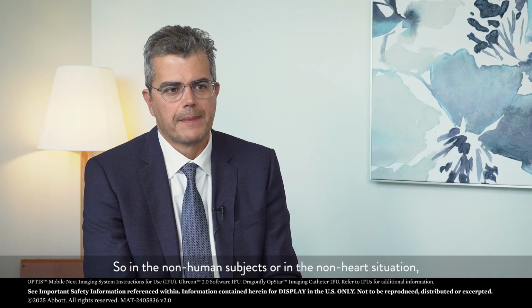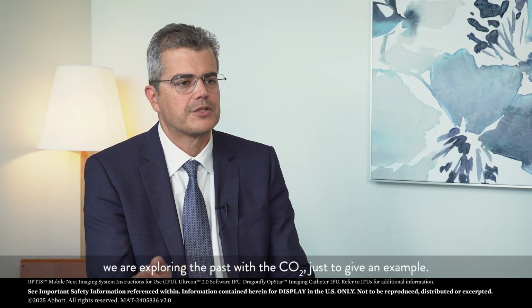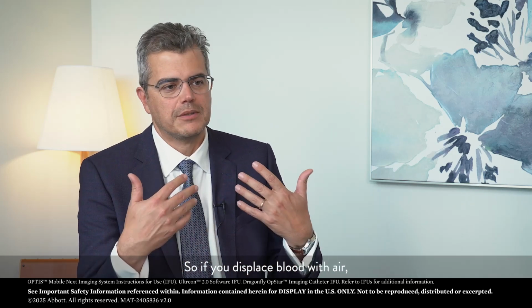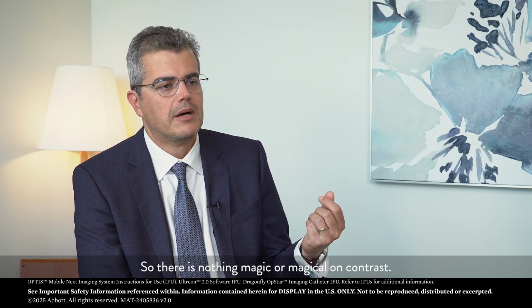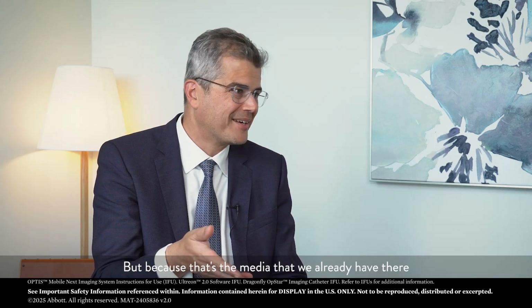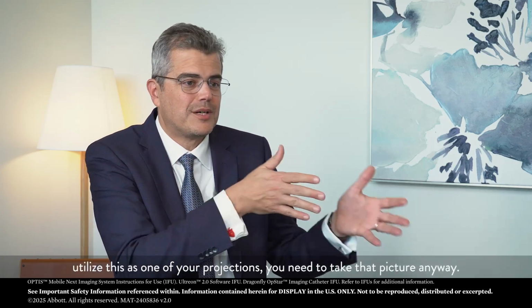So in non-human subjects or in a non-heart situation, we explored in the past with CO2, just to give an example. So if you displace blood with air, you're going to acquire a quality OCT image. There is nothing magical about contrast, but that's the media that we already have there, and because I always preach, when you do your OCT pullback, utilize this as one of your projections.